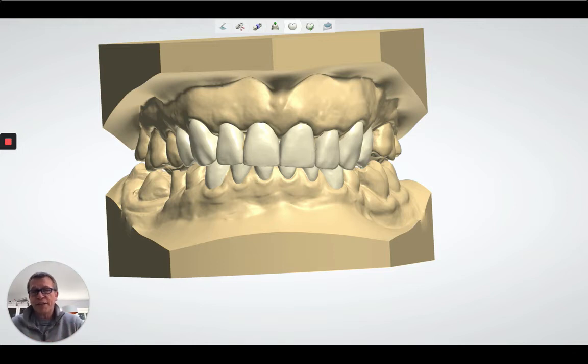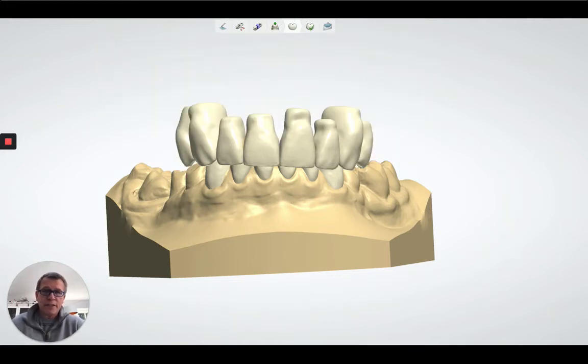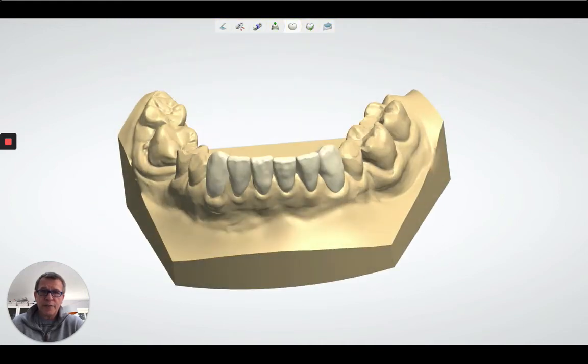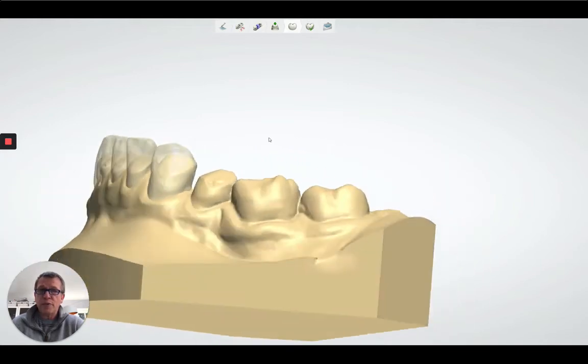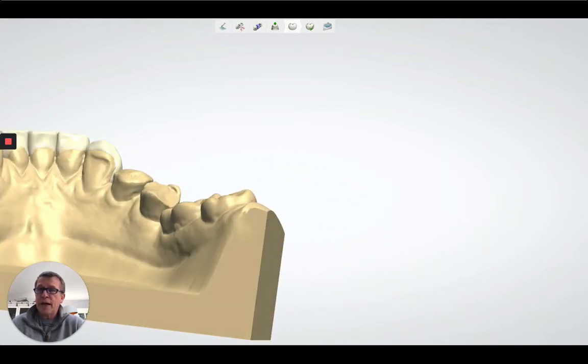We can try this in the patient's mouth, and that's going to give us huge amounts of information, okay? Not just to motivate the patient. And again, one of the cool things with digital is this is really pretty inexpensive to do, and it doesn't take too much time if you want to learn how to do it. So, this is a very simple little mock-up that Shemek did for me. He does it beautifully, like he does everything. But we can see where those teeth have been added on. We just pull these teeth in from a library. And it's like everything else.